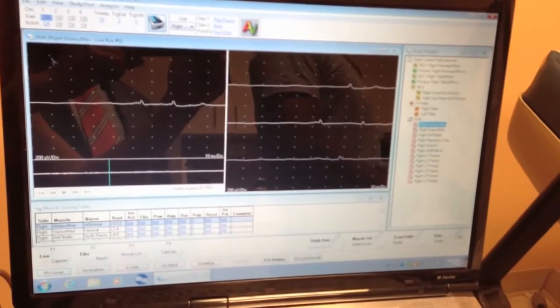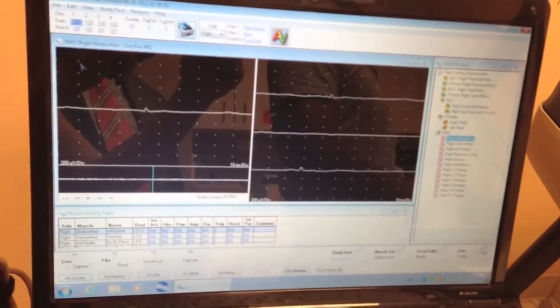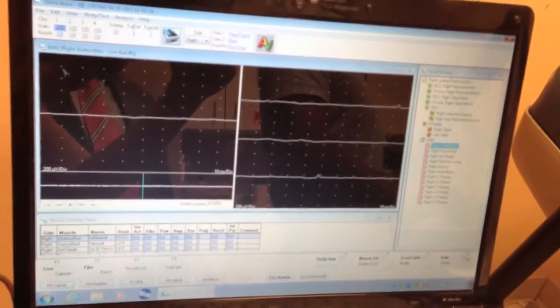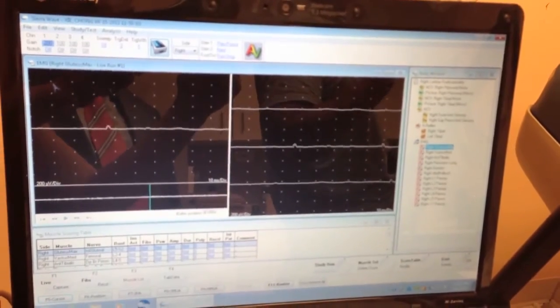There's no contraction right now. Start slowly and then gradually you're increasing. Show me I'm standing, I'm not doing any movement, right?